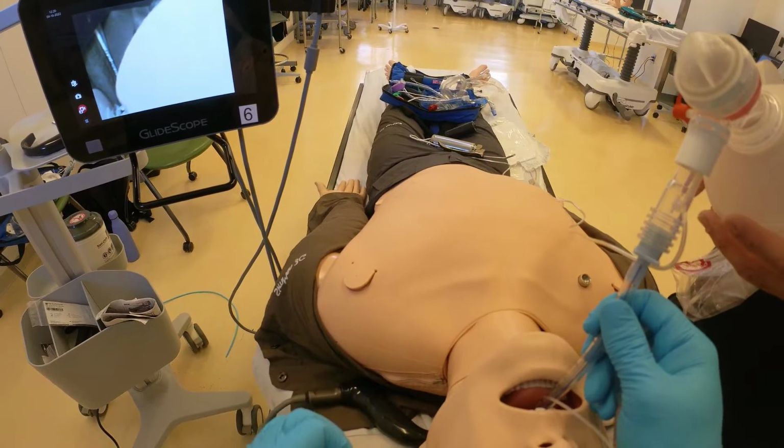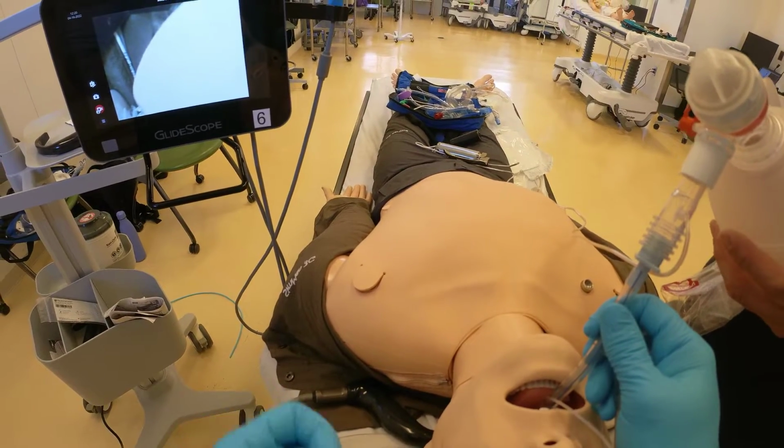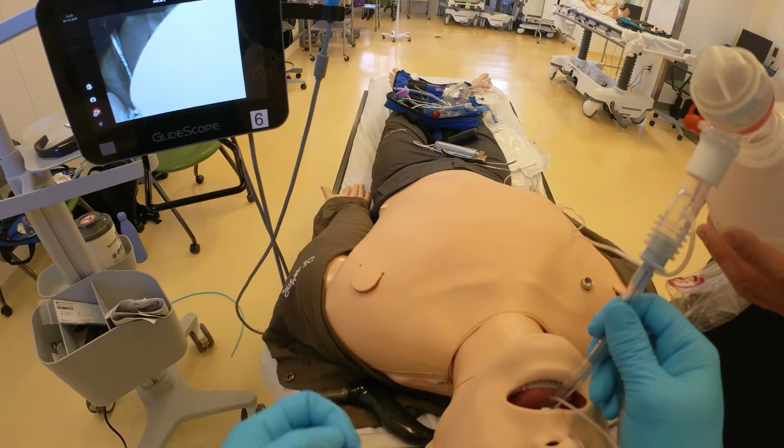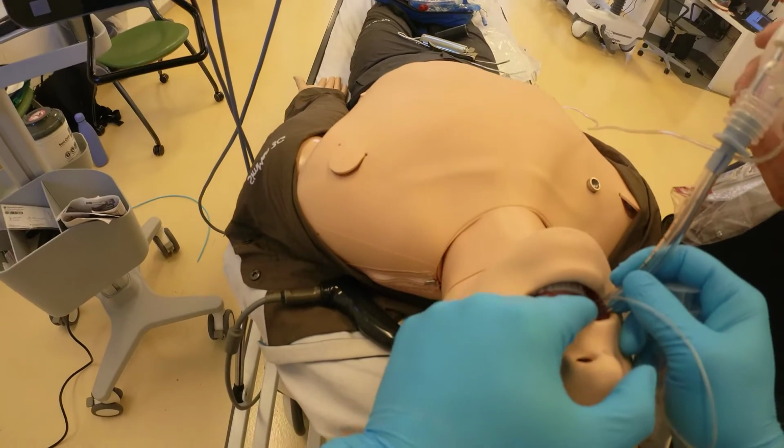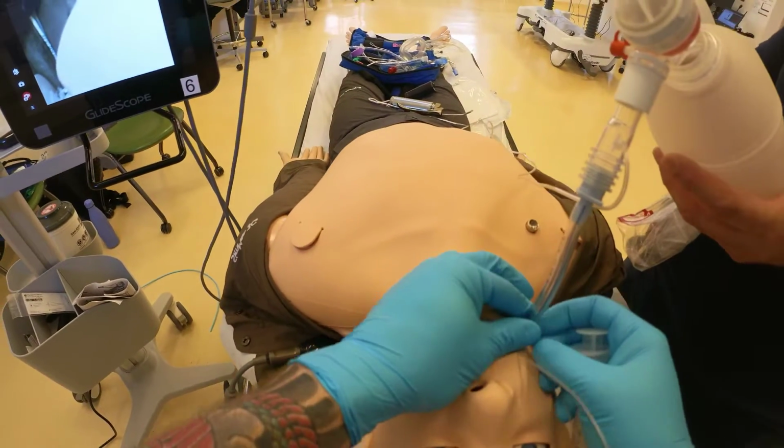I saw the tube go through the vocal cords. End tidal CO2 was 40, pulse ox was 98. I have bilateral breath sounds upon auscultation, right? And I note that my tube, right, was 20 at the lips.